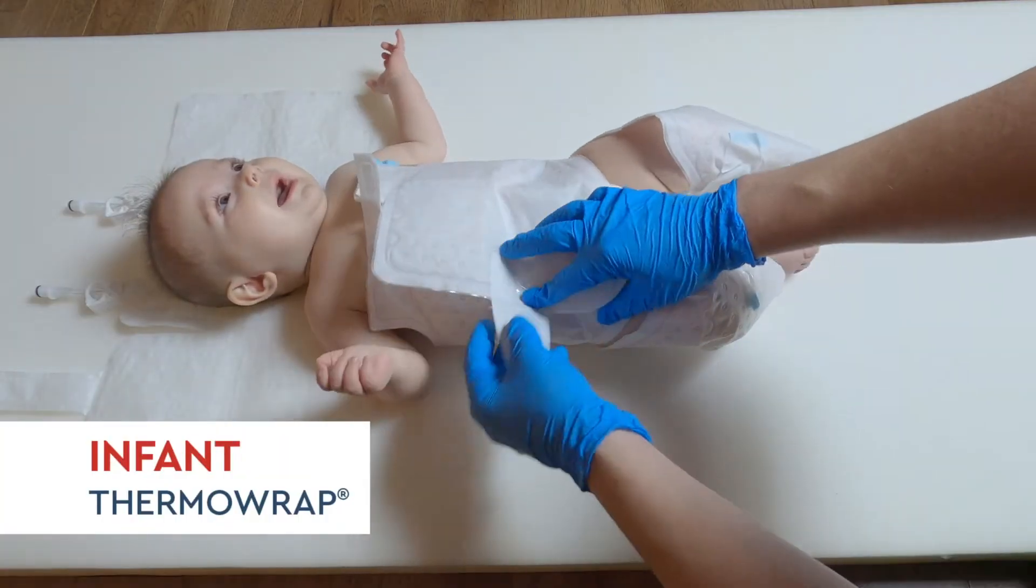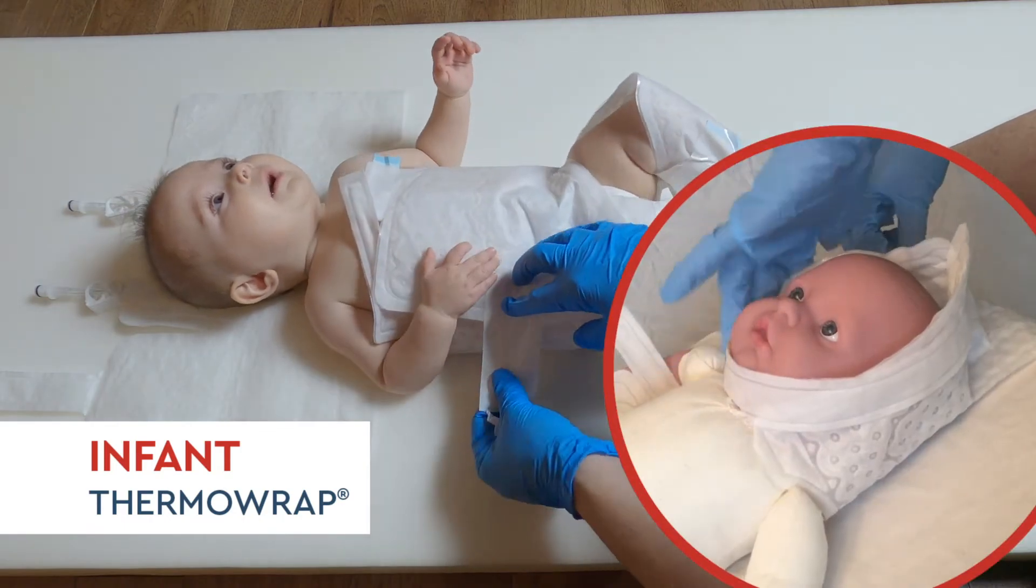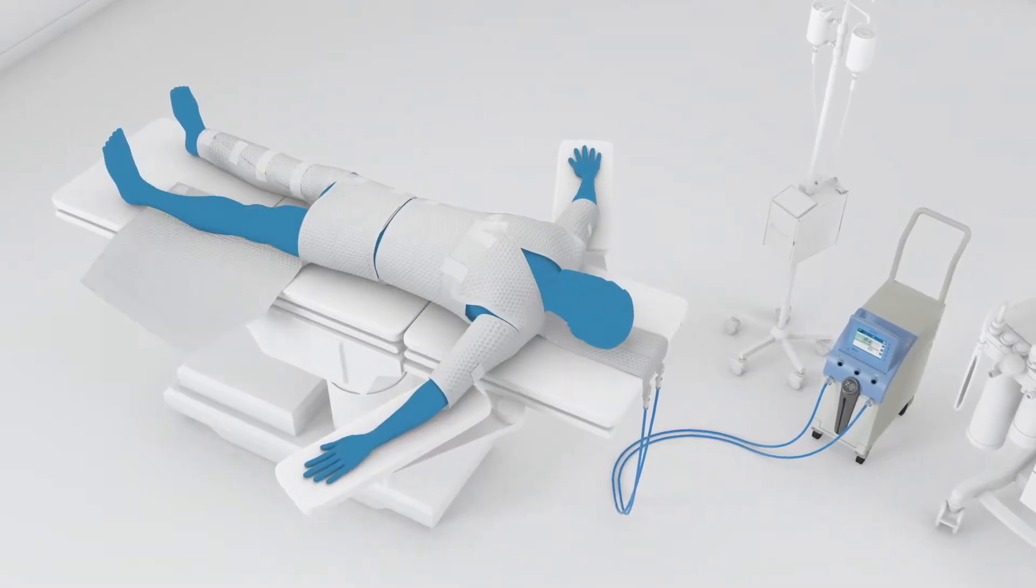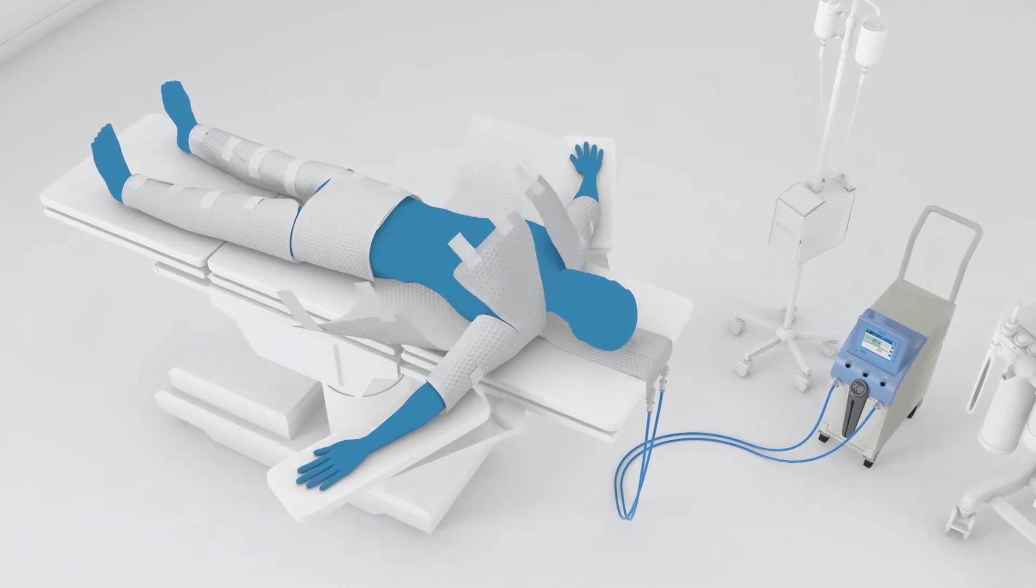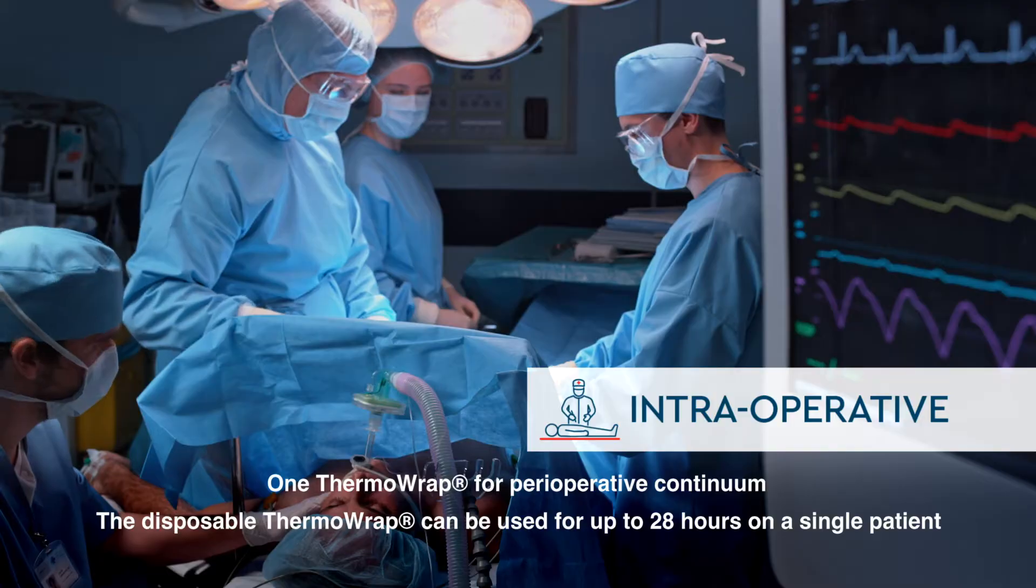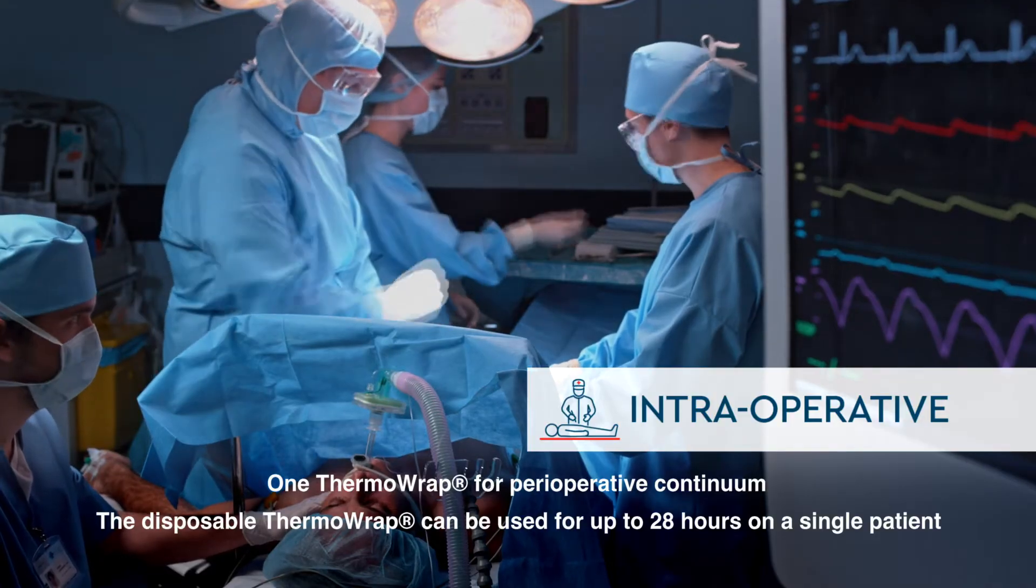Infant thermo-wraps cover the baby's head to reduce heat loss. All thermo-wraps can be adjusted and positioned as needed for the appropriate surgical procedure. And only one thermo-wrap is used per patient for the entire perioperative continuum.